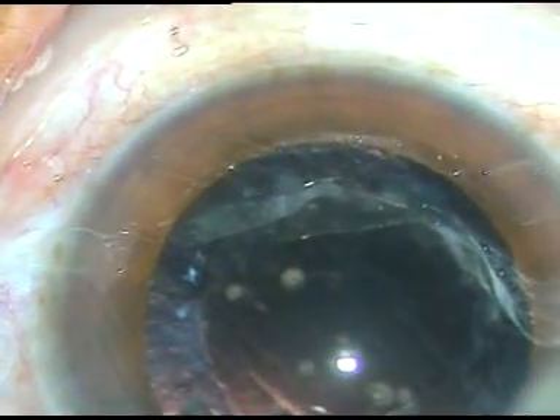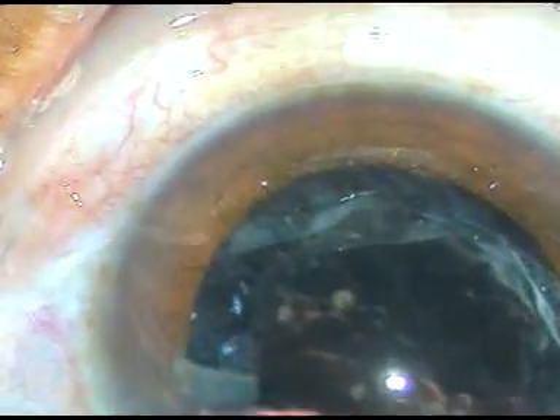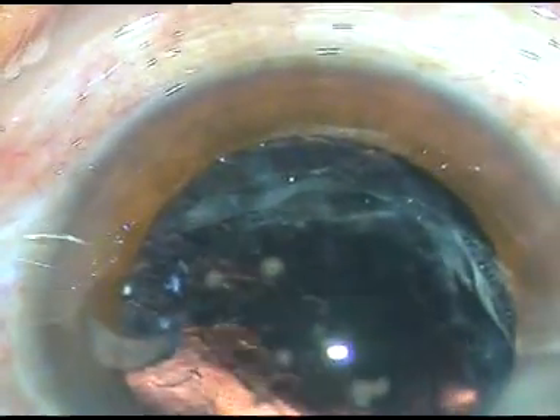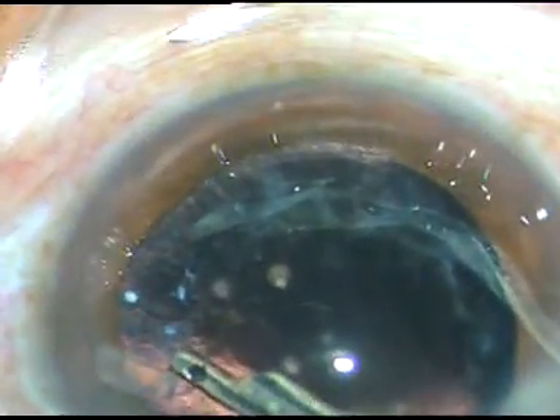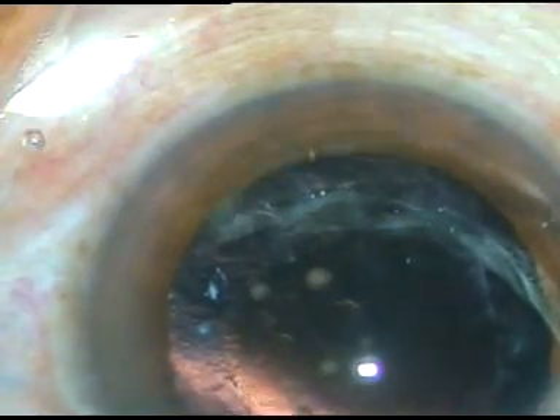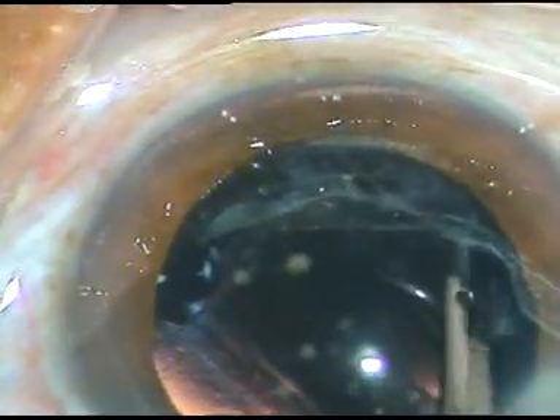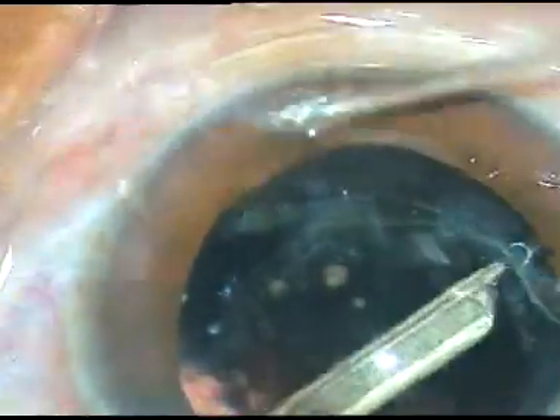I inject some amount of viscoelastic and you can see a small nuclear fragment at around 3 o'clock. I must remove that first, because otherwise it can get lost somewhere under the iris. Now the cortical lens matter is being removed by Simcoe cannula. You can see that there are a lot of fibrous plaques on the posterior capsule; fortunately the central part is clear, so I am not bothered about the peripheral plaques.